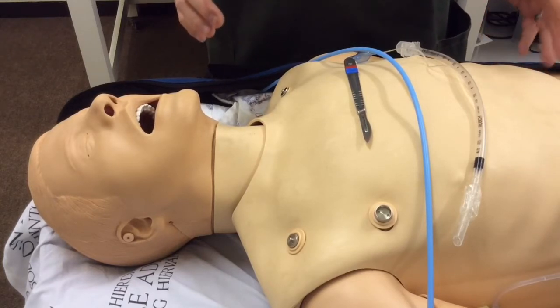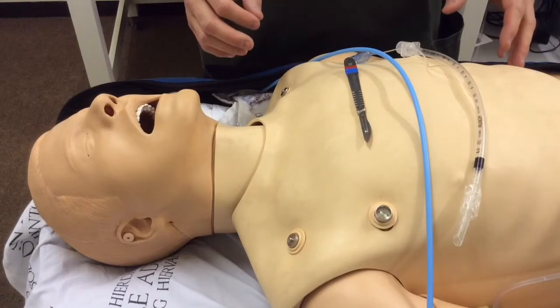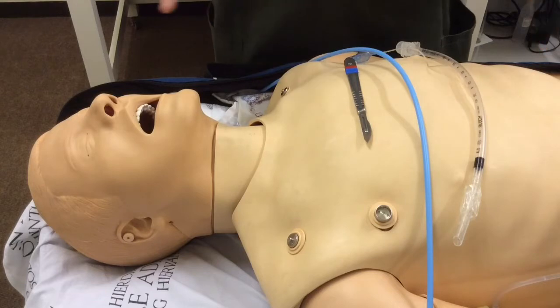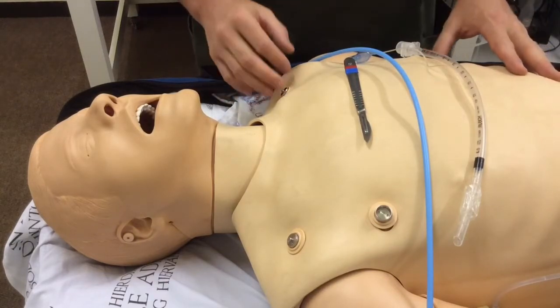I'm not going to go into the debate about needle versus surgical cricothyroidotomy, and I'm also not going to go into the debate about scalpel-finger-bougie versus scalpel-bougie-tube. I'm just going to demonstrate the DAS technique on this mannequin.